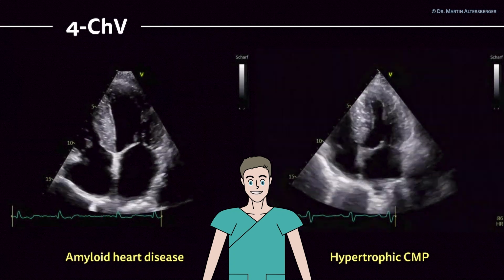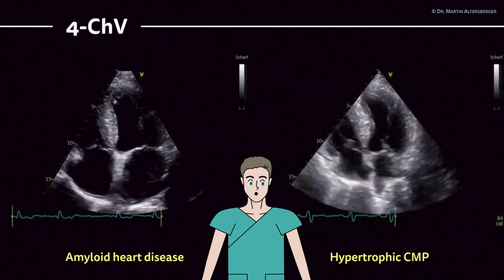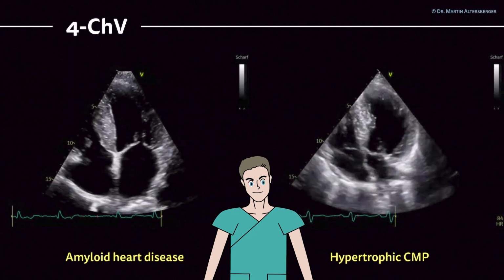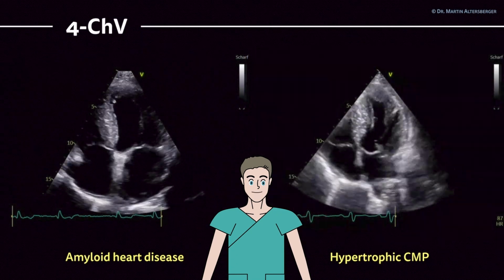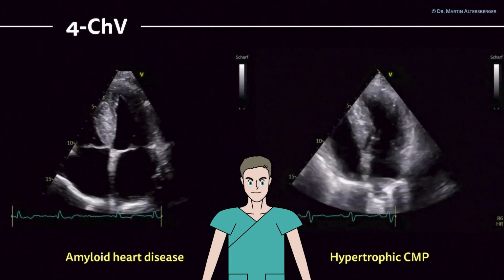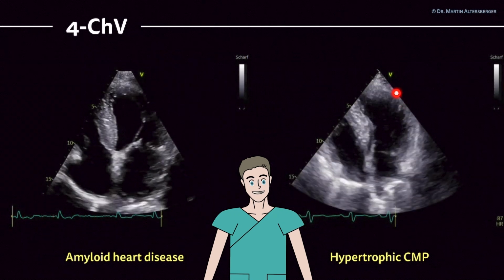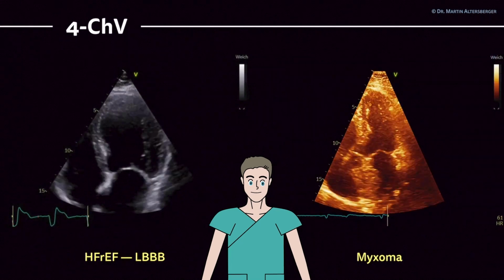We see this especially in a septum hypertrophied ventricle with a high normal ejection fraction in the range of 60 to 65%. We also see a hypermobile interatrial septum, and the thickening, especially in the septal regions, is severe, but the anterolateral wall is also thickened. The papillary muscles are also hypertrophied.